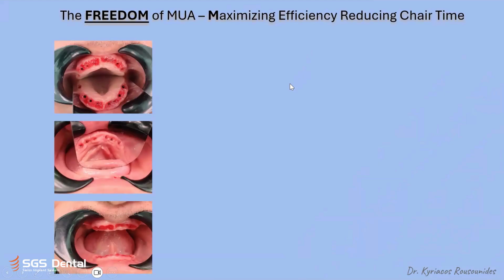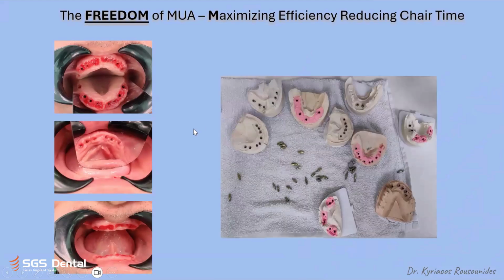Here are some other cases, old cases of mine that we used to do with single abutments. And we see here a picture. I don't remember if it was a discussion or a fight with me and my assistants or with me and my technical lab. And they mixed everything up, so I couldn't find the right position for anything. You can imagine how difficult it is to make this puzzle work again. You need days to correct all this and find the right abutment for all of these parts.